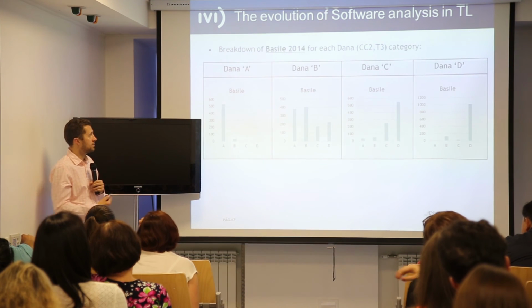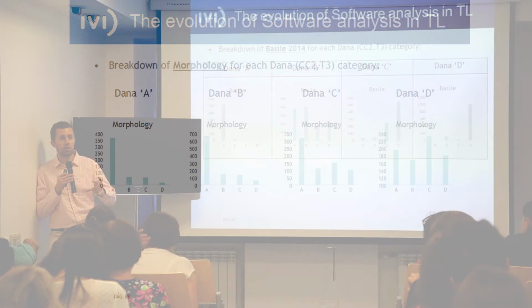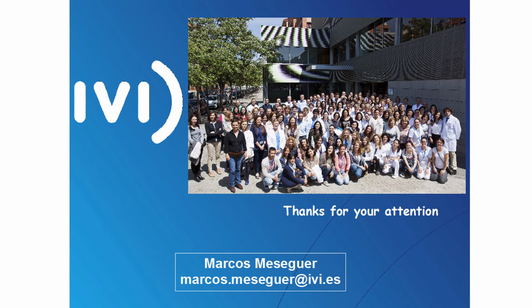So let's say this is based on an automatic system. It's an automatic software. It allows you to do a classification of the embryo immediately. You don't need to create any kind of algorithm, and it works. Okay? So this is an example of what will be the future.